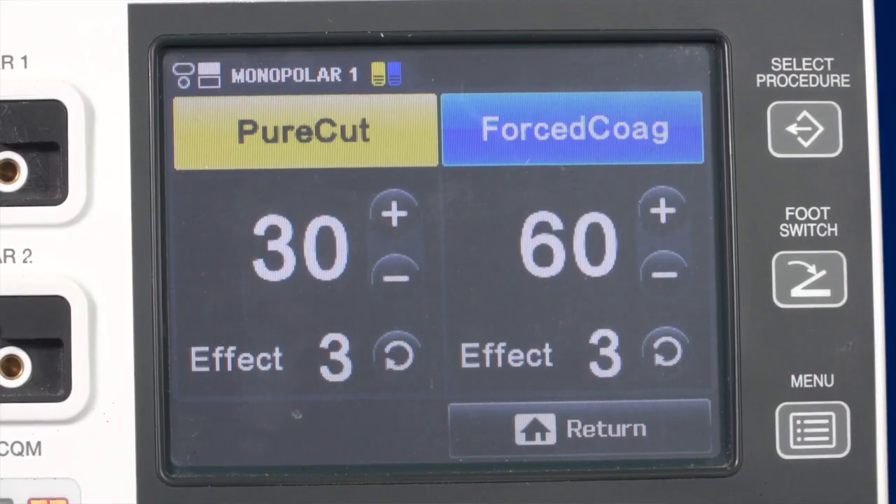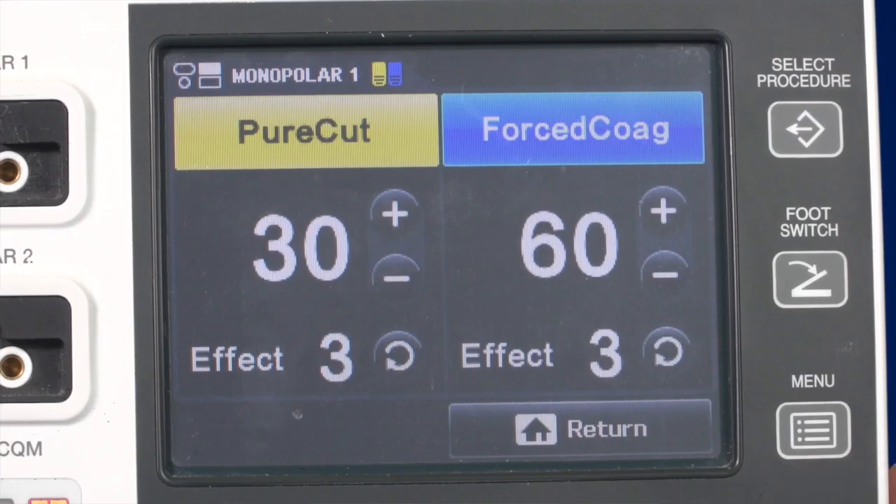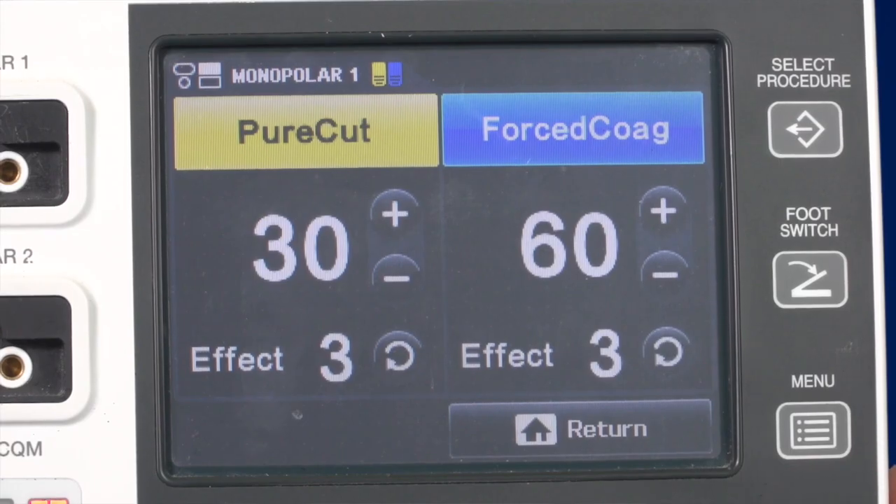Most generators on the market only allow you to change the power level. The ESG400 also has an additional feature called Effect. You can choose Effect 1, 2 or 3. By changing the effect, the user can make quick adjustments to the energy output. The higher the effect level, the more tissue effect you will achieve. As a rule of thumb, use a low effect for fine instruments and a high effect for larger instruments.